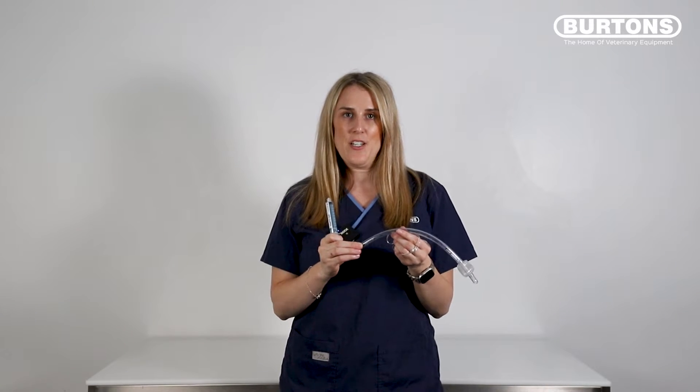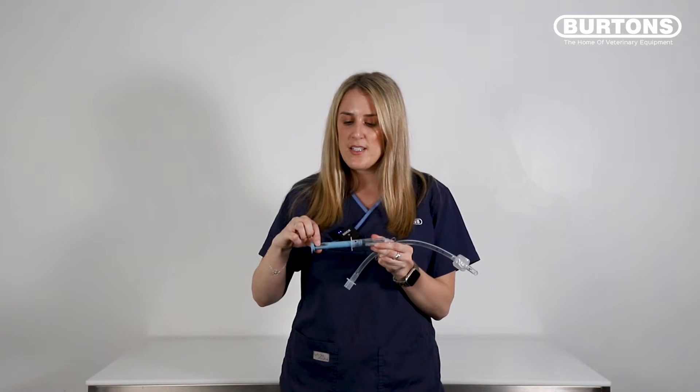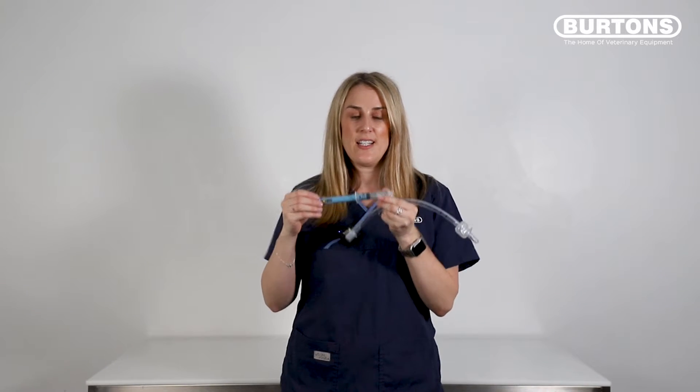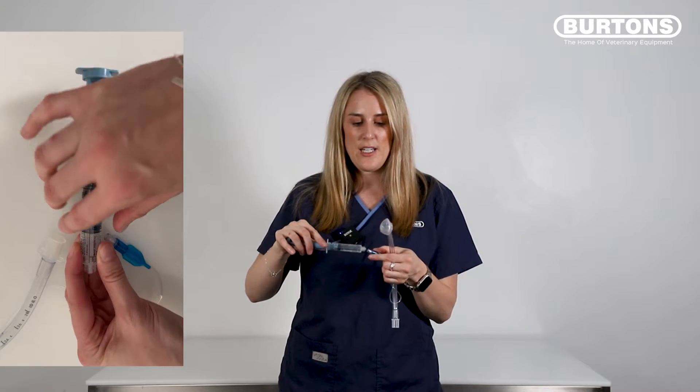After the device has been placed in our patient and we want to inflate the cuff, all you need to do is pull back on the Cuff Fill, turn it on using the yellow button. It'll blink and show two zeros, which means it's currently reading zero pressure — correct because it's open to the room — and then we just attach it to our cuff inflation line.